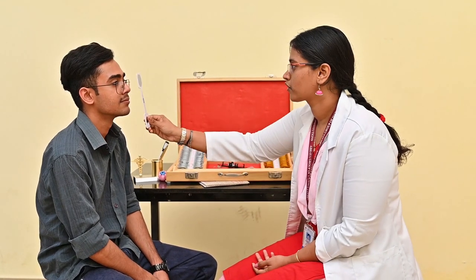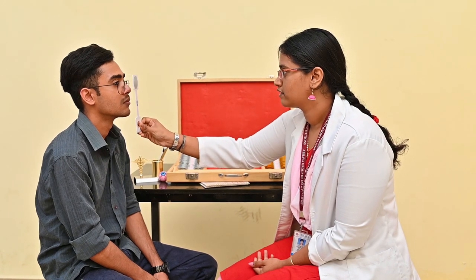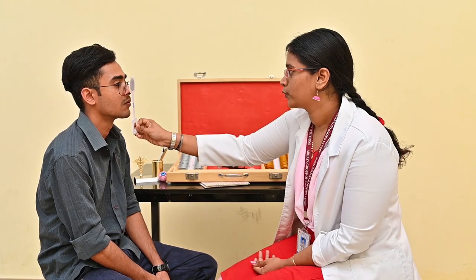When you are doing this practically, use 15 counts as a clinical tip. You have to do 15 tests total — three times for each eye per test. Starting with the cover test: right eye — one, two, three — then left eye — four, five, six. Then doing the cover-uncover test, starting with the right eye — seven, eight, nine — then left eye — ten, eleven, twelve. Then doing the alternate cover test — in this there is no right or left eye, you are just alternating the occluder between both eyes — thirteen, fourteen, fifteen. That completes the sequence.